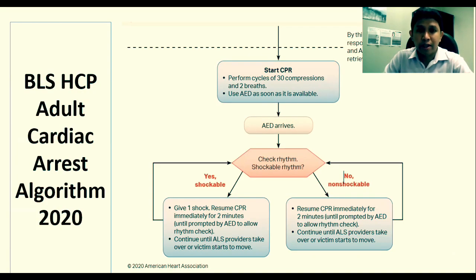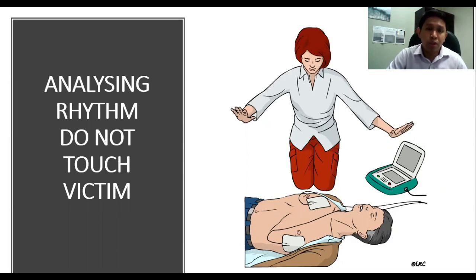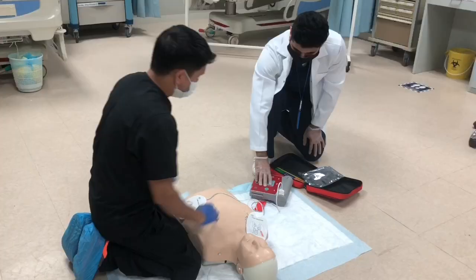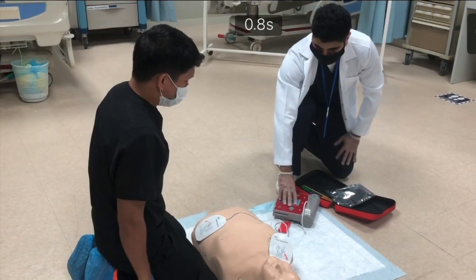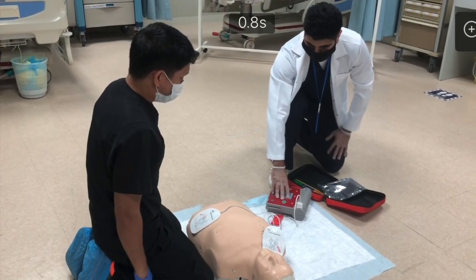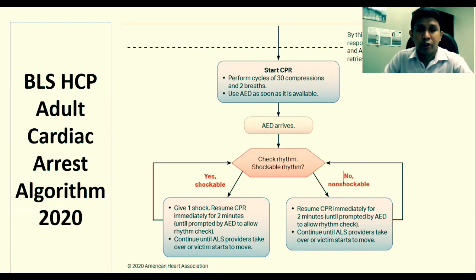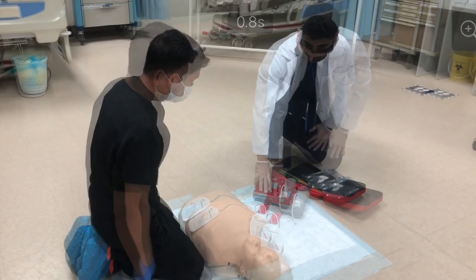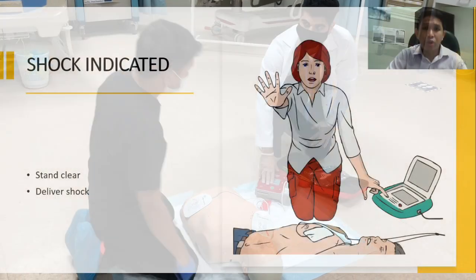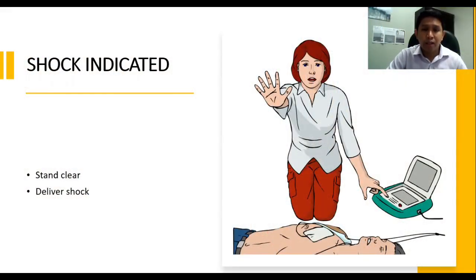Check rhythm — the machine will indicate whether shock is advised or no shock is advised. Stay clear of patient. Analyzing heart rhythm. Shock advised — stay clear of patient. If shock is advised, give one shock and then resume CPR immediately for two minutes until prompted again by the AED. Continue until the ALS provider takes over or the victim starts to move. Both should stand clear before pressing the shock button: I'm clear, you're clear, everybody clear.